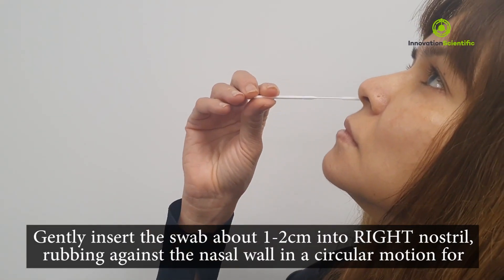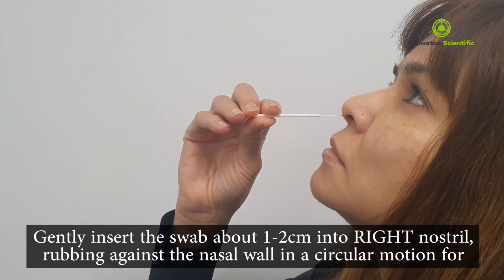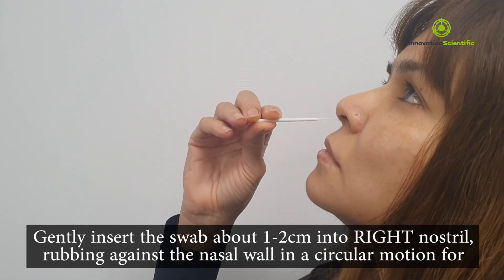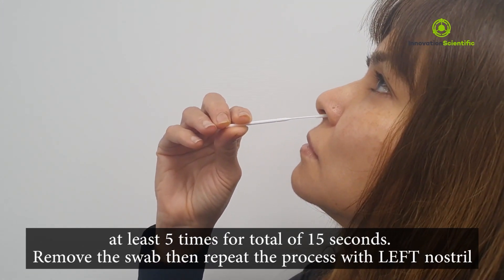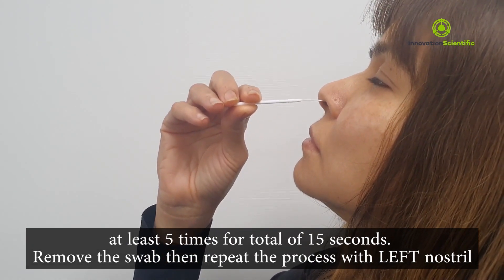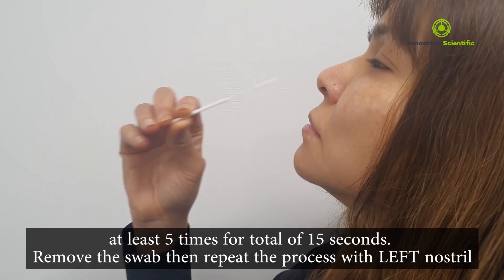Gently insert the swab about one to two centimetres into the right nostril, rubbing against the nasal wall in a circular motion for at least 5 times for a total of 15 seconds. Remove the swab and repeat the process with the left nostril. The sample is collected by the swab when it brushes against the walls of the nasal path.